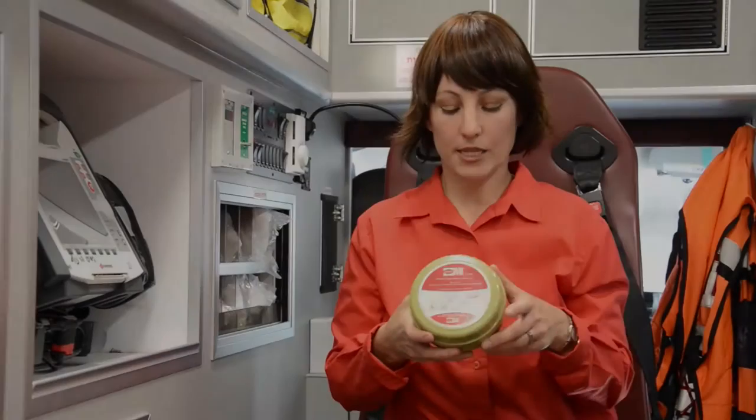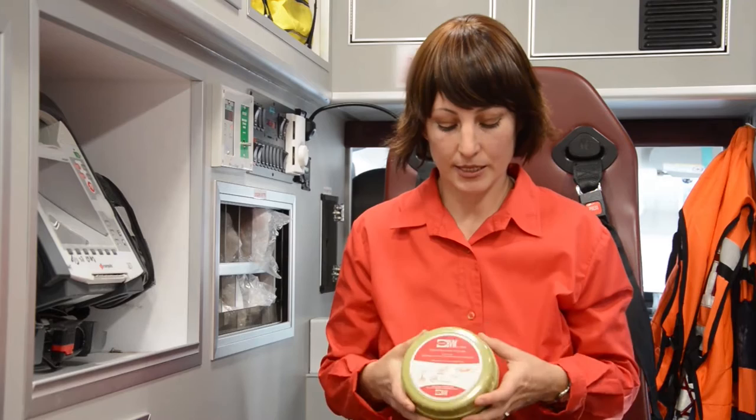This is the Pocket BVM with O2 tubing. What makes this product unique is that it comes in a very compact package. It saves you about 75% of space in your emergency kit.